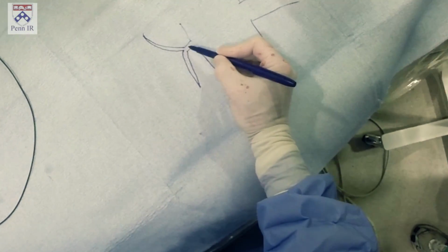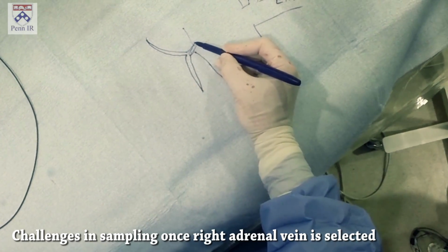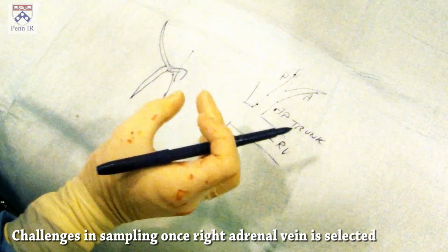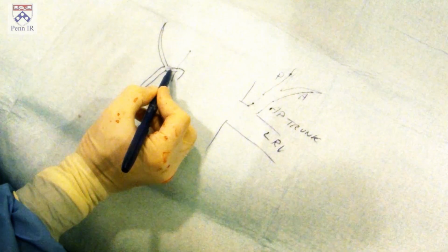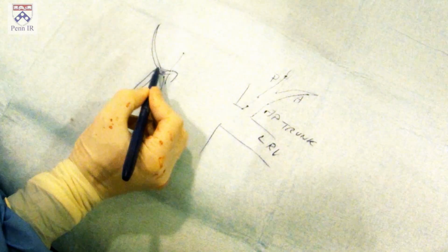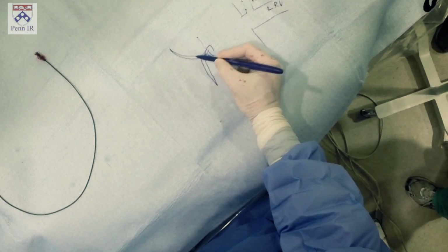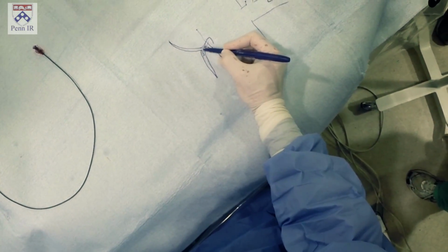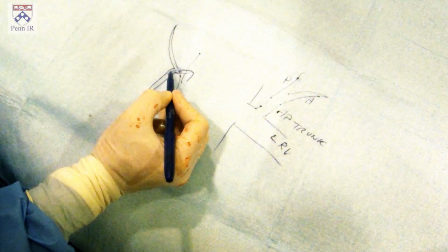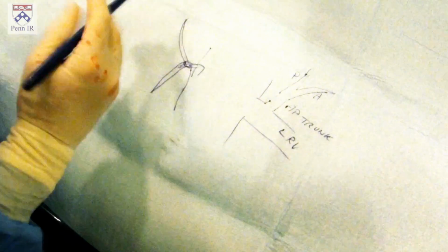As you can imagine here, it's a very, very short configuration, so your catheter is only in a couple of millimeters. Because of this, having that side hole there actually makes a big difference. The side hole, because it's on top of the catheter, may account for getting flow out of this upper limb if the catheter tip is down in the lower limb. But it also just allows it to flow better, because otherwise it gets up against the wall right here, and then it just can't aspirate.